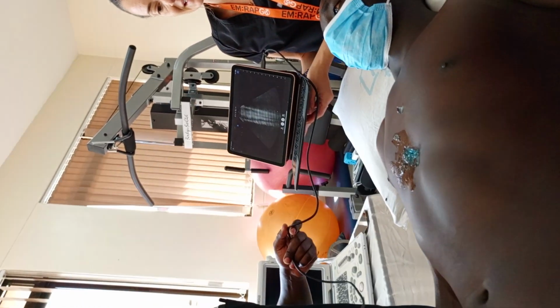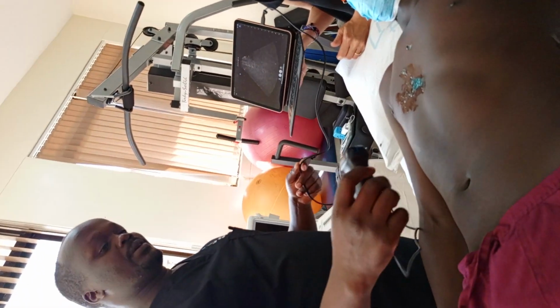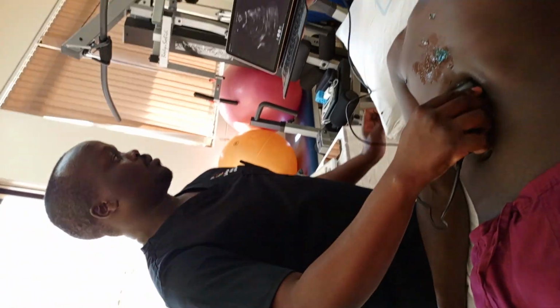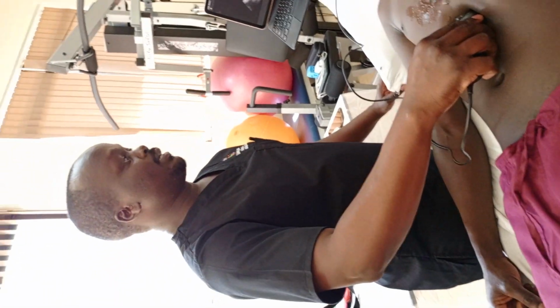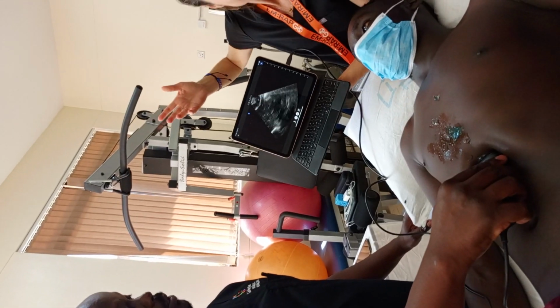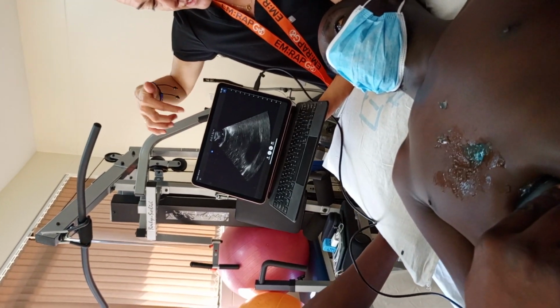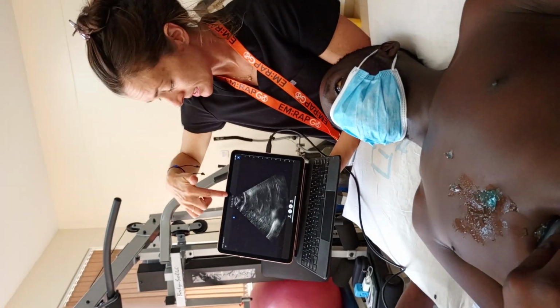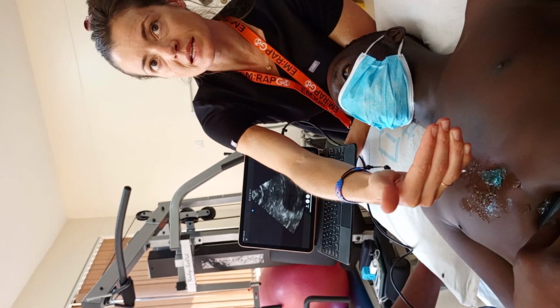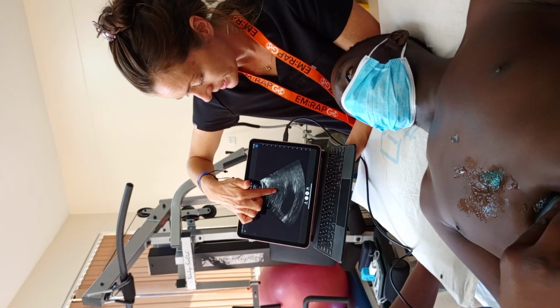All right, let's see our subxiphoid. So this is the time where the indicator is to the patient's right. All right? I'm checking the heart. So what's this thing? That's a heart. Yes, great. Okay, so remember, just to orient us, his probe is touching skin. It's still going through a bit of the liver that's extending over, and then we go through that bit of the liver to the heart.